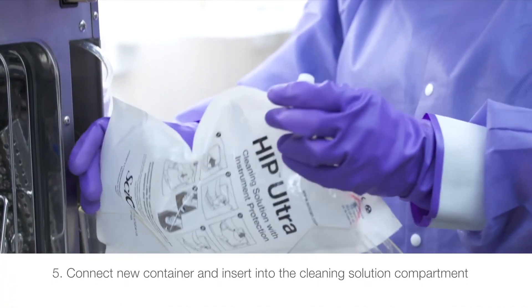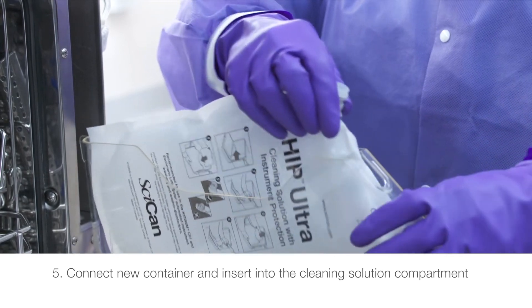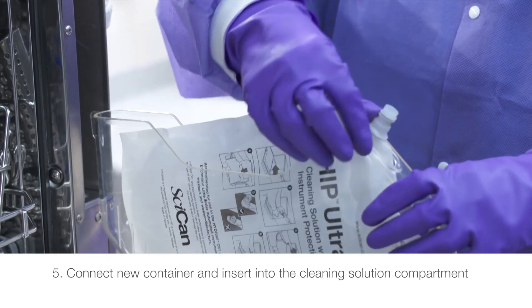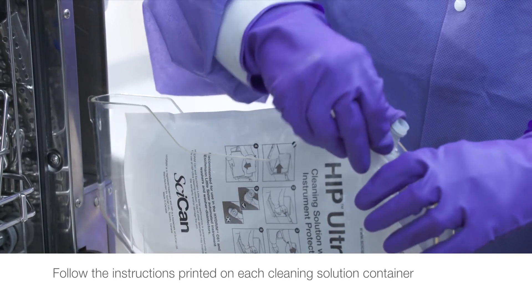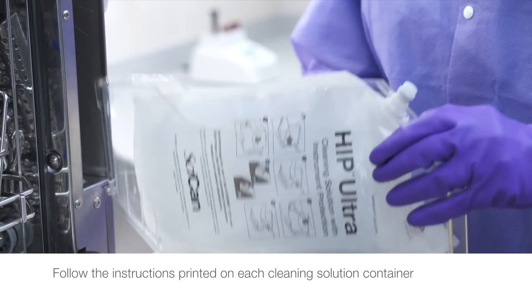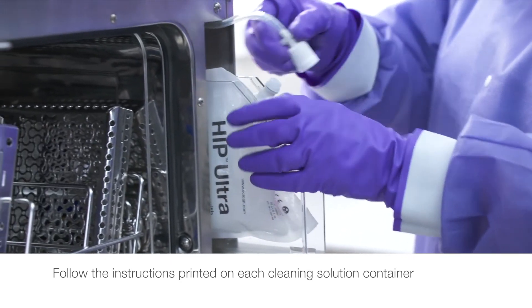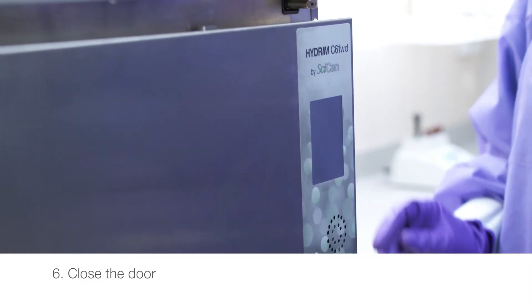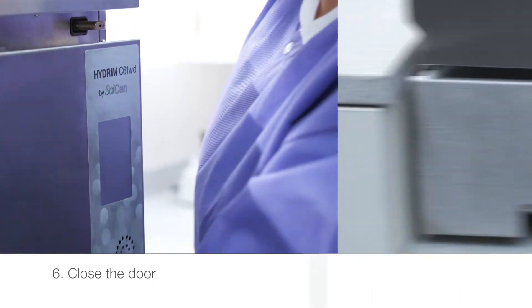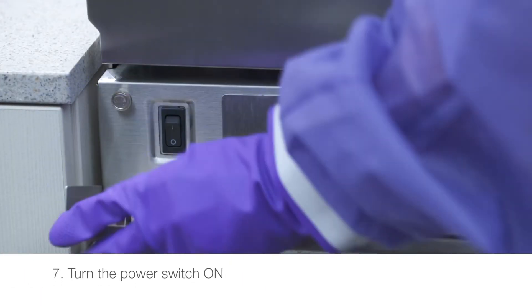Connect new container and insert into the cleaning solution compartment. Follow the instructions printed on each cleaning solution container. Close the door. Turn the power switch on.